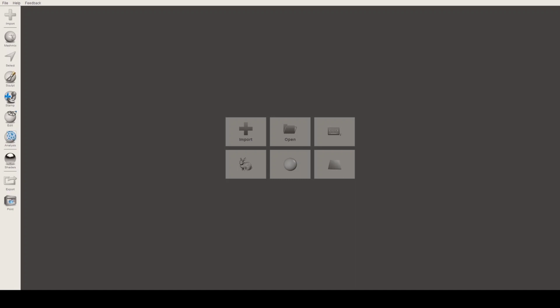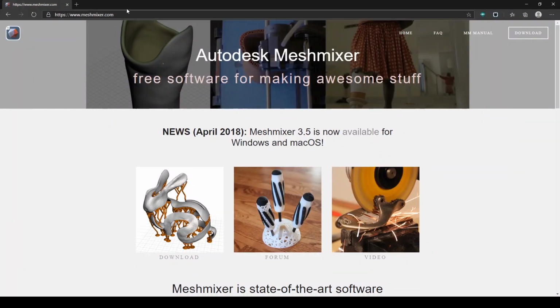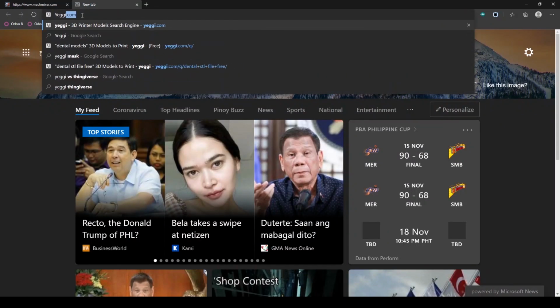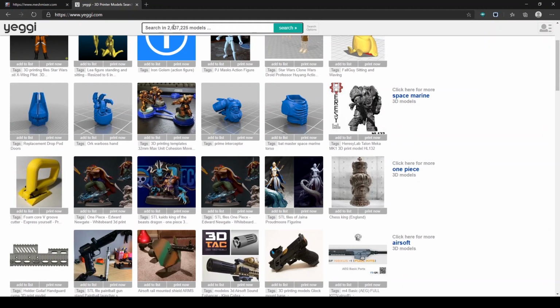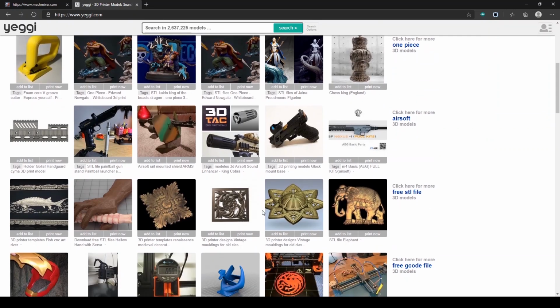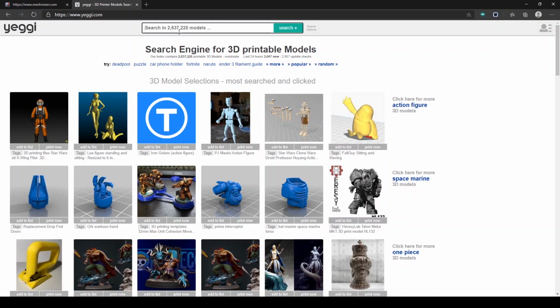So what we're gonna learn in this video tutorial is the basic functions of Meshmixer. Manipulating 3D models is one, but let's focus on manipulating dental models. I found a dental model from this site over here, yeggi.com, and it's basically a website that gives you a lot of options for 3D models. You can pay for a 3D model if you want to have fun with it. If you have a 3D printer back home, then this website is really useful for you guys or girls.